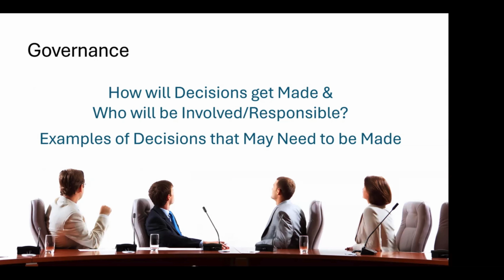Typically, organizations form what we call a multidisciplinary team. It can involve radiology department leaders, PACS admins, or other roles that understand things like order fields and DICOM attributes. It can involve health information management team members who know about EMR record retention practices and policies, and other key stakeholders, including imaging researchers, people responsible for modality calibration exams like phantoms, and clinicians who access this data.